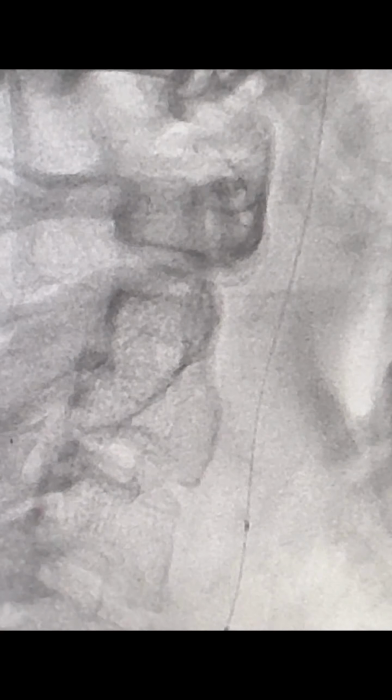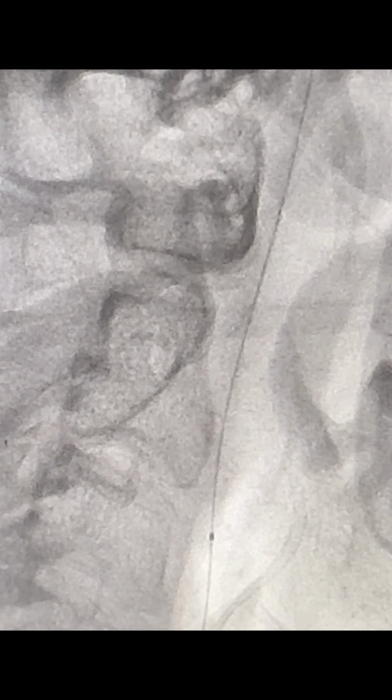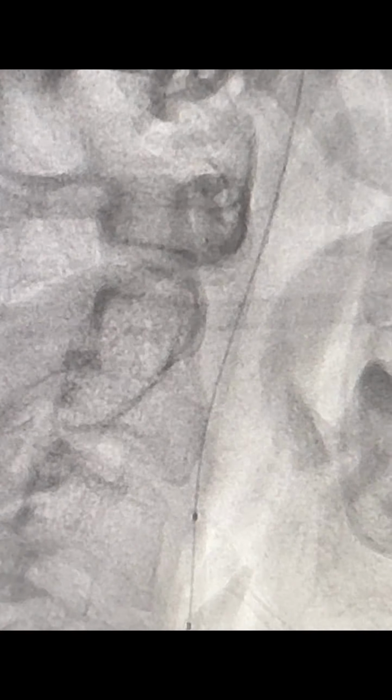Now we are dilating that narrowed stenotic part with a 1 millimeter coronary angioplasty balloon. So we were able to dilate the narrowed segment by carefully angioplasting this lesion with the 1 millimeter balloon. So we were able to form a tract through which the embolic protection and stent could be deployed later.